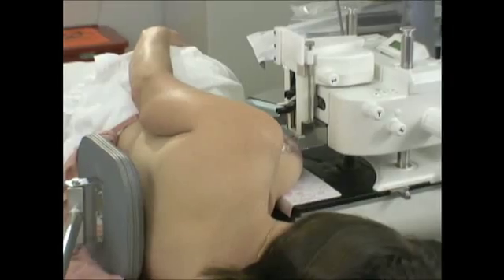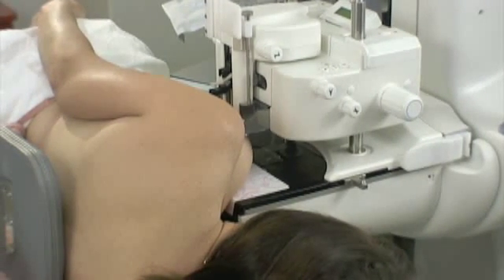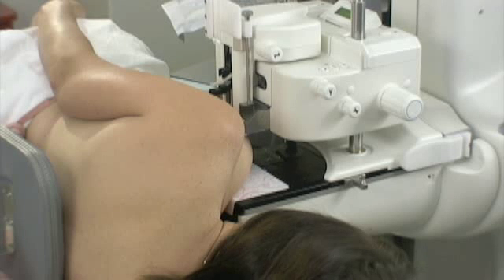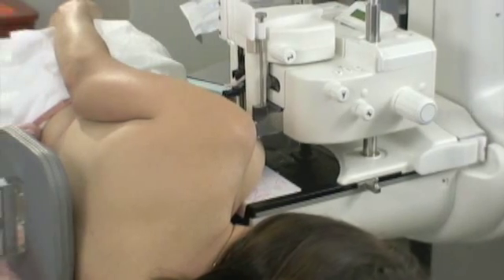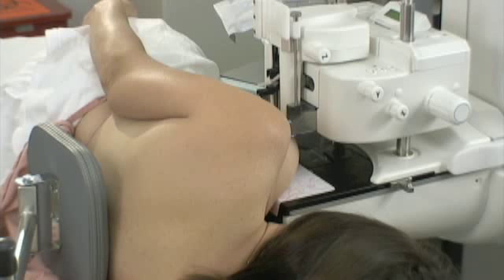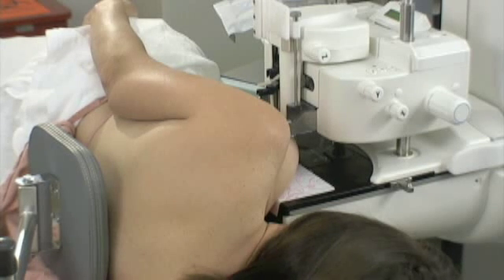We're going to take our first scout picture. Our initial scout demonstrated calcifications at the posterior aspect of the biopsy window, so we repositioned the patient to create a situation where the calcifications are more in the center of the biopsy window. We are now going to tee up the scout image. The calcifications are right in the center of the biopsy window.